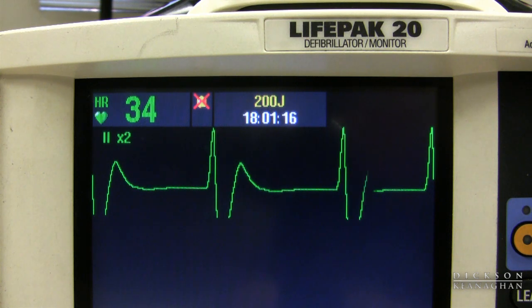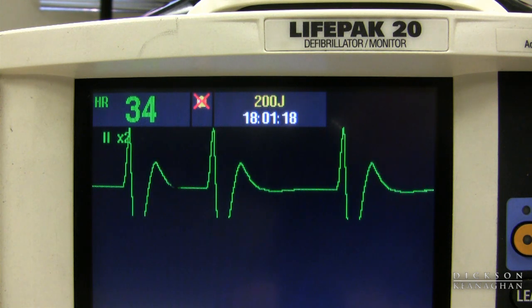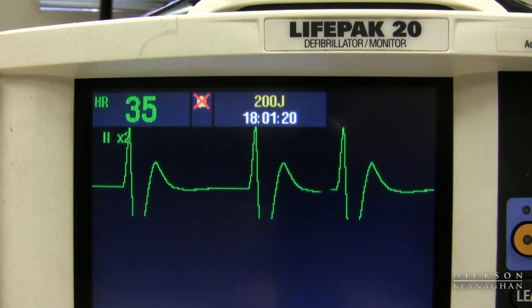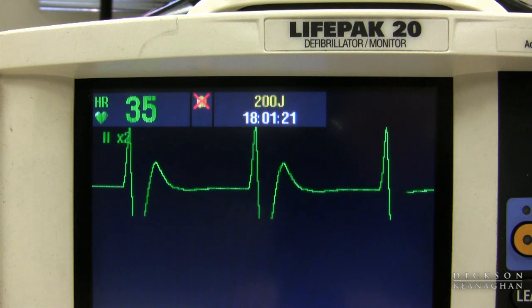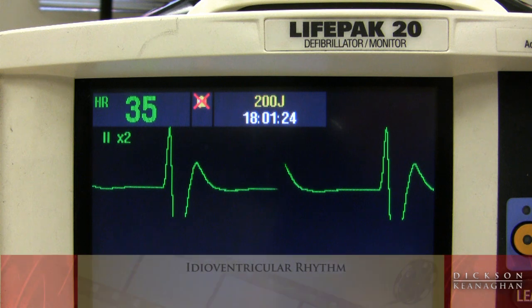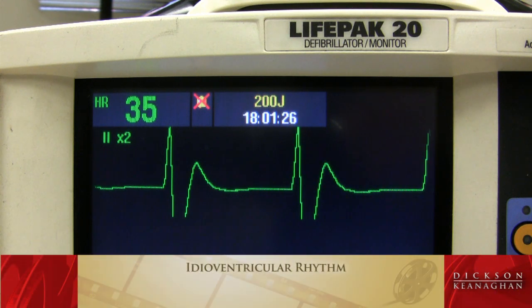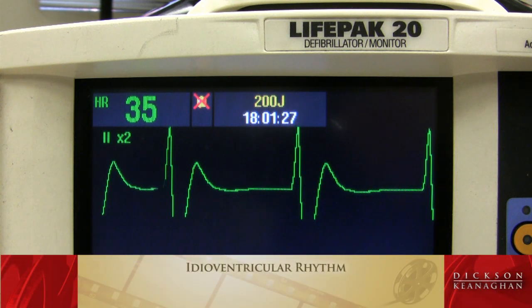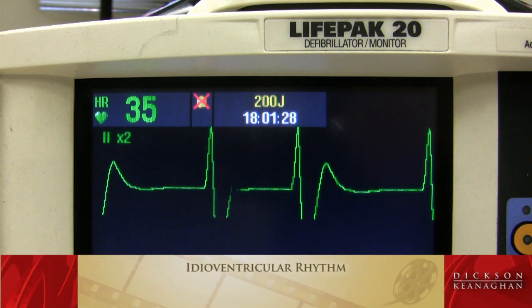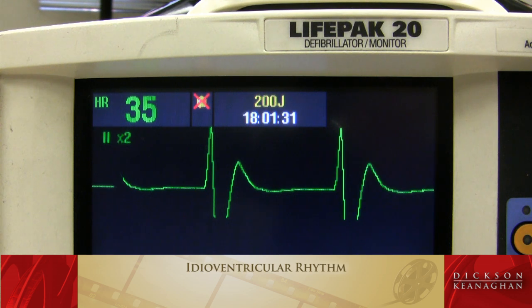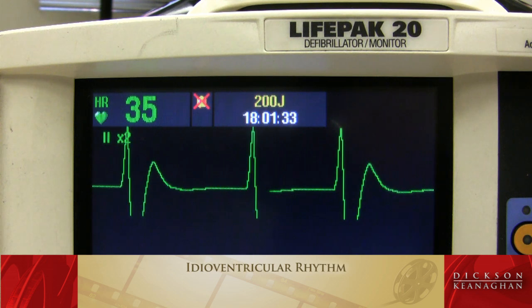This is a slow rhythm. The QRSs look wide, originating in the ventricle. This is often called an idioventricular rhythm. The patient may be stable, but this also could look like a rhythm after a patient has coded — there may or may not even be a pulse.